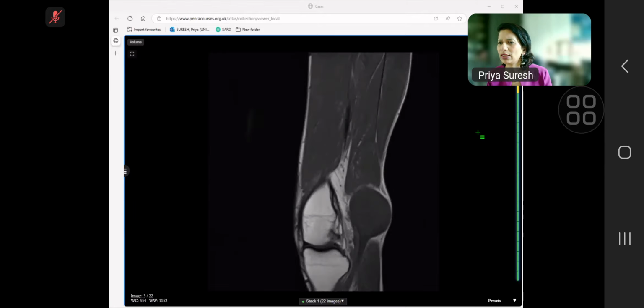So this is the post contrast. There are multiple other lesions also appreciated along the posterior aspect of the thigh. And the lesion which I mentioned before is non-enhancing, while the rest of the lesions in the upper part show marked post-contrast enhancement. These are inseparable from the muscles.